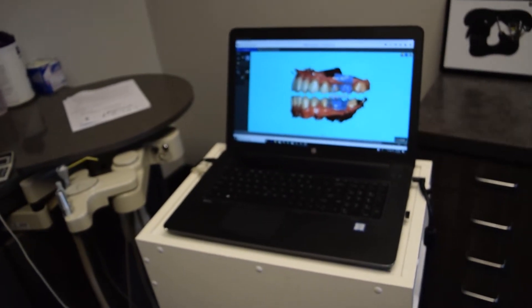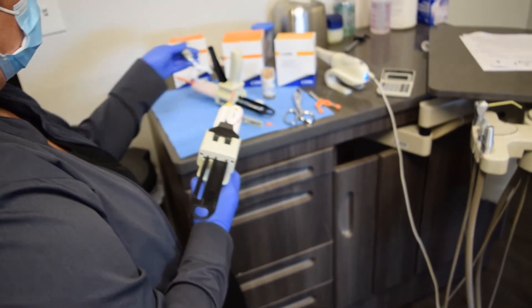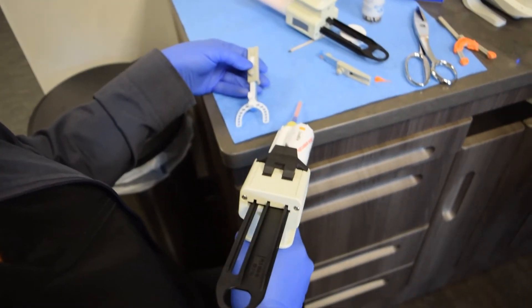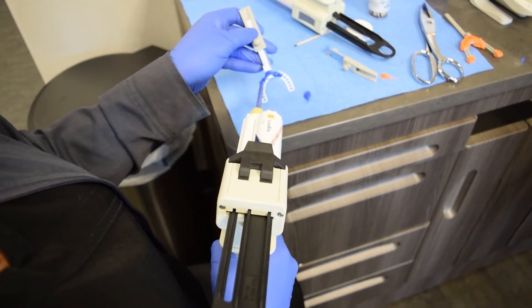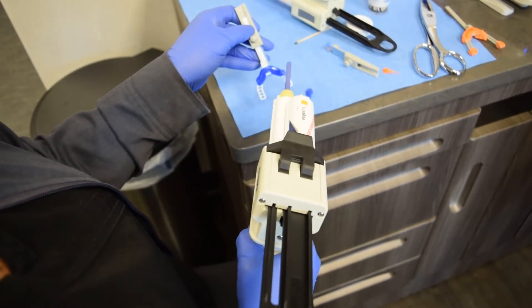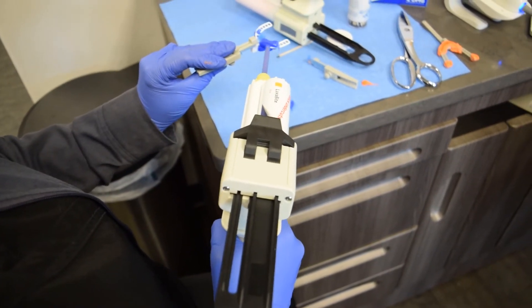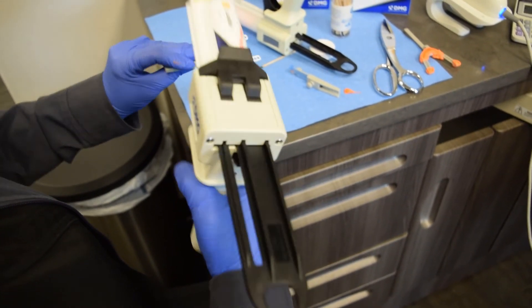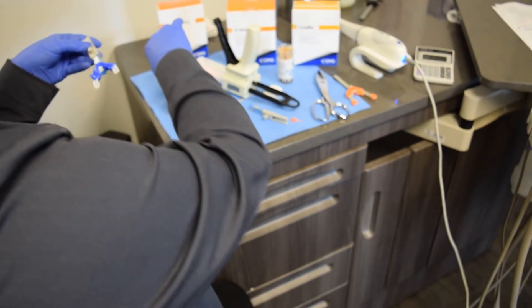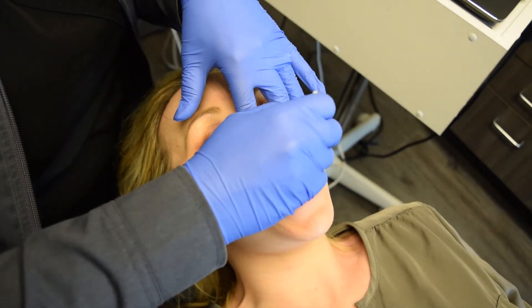The same principle works with the luxabite — it's a little bit more rigid. Another way you can do this is just put it on the front six teeth; you don't even have to do the molars. I've done probably hundreds, if not close to thousands of bites this way, and this has been very accurate. Some people feel more comfortable catching the second molars, but I've done it both ways and can't tell any difference. You would do this here with the luxabite — have them bite down and hold that.